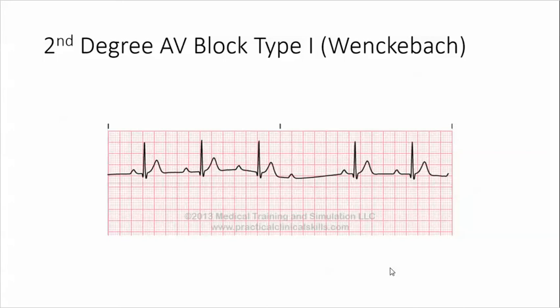In this strip, the QRS complexes are normal. For every QRS, we have a P wave — a normal P wave. That means the conduction went through normally to the ventricles.